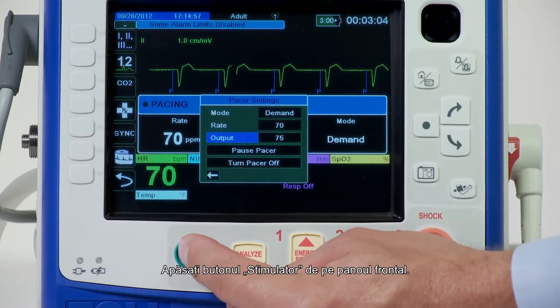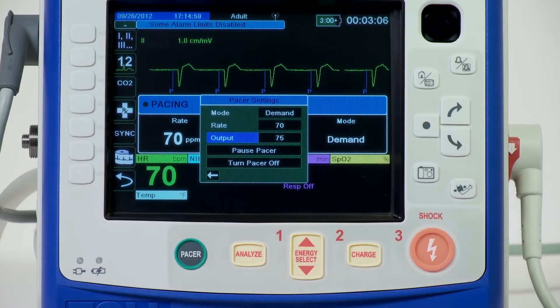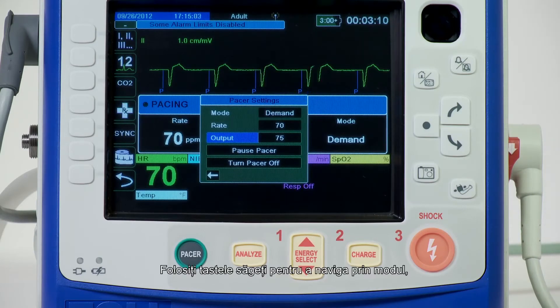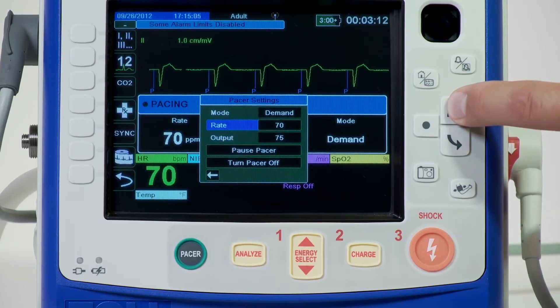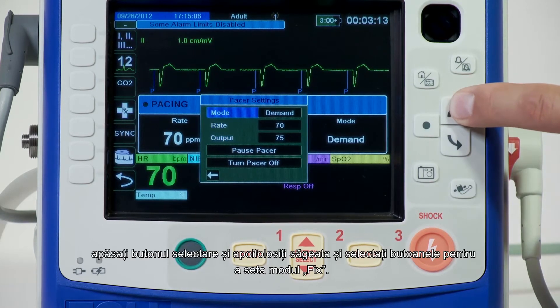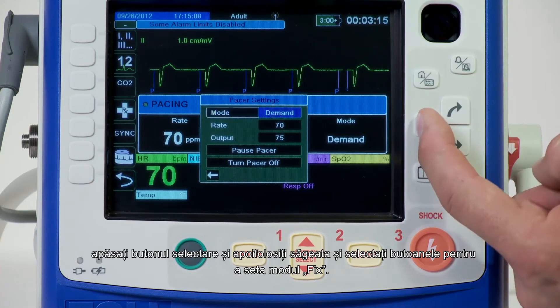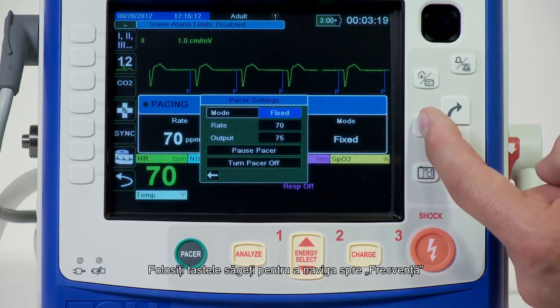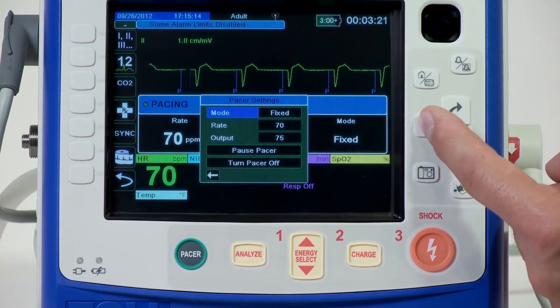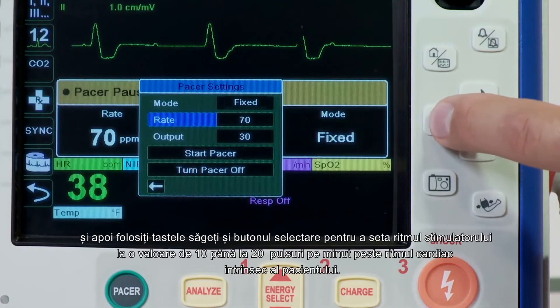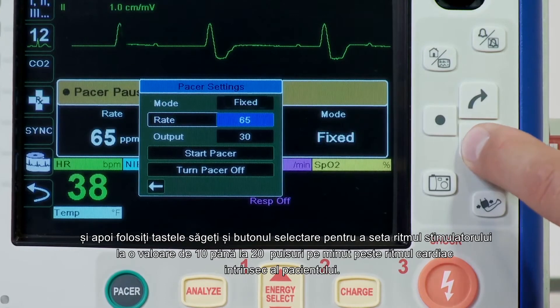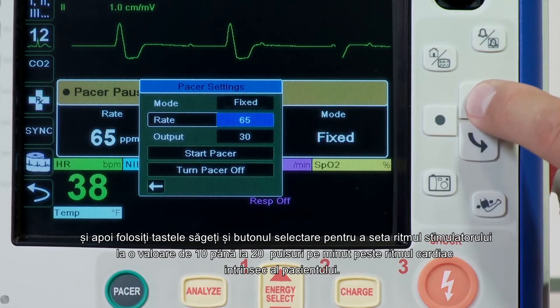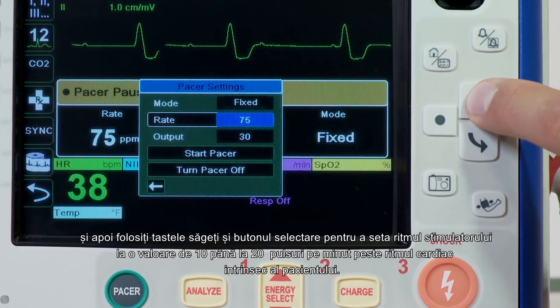Press the pacer button on the front panel of the unit. The pacer settings window displays. Use the arrow keys to navigate to mode, press the select button, and then use the arrow and select buttons to set the pacer mode to fixed. Use the arrow keys to navigate to rate, press the select button, and then use the arrow keys and the select button to set the pacer rate to a value 10 to 20 paces per minute higher than the patient's intrinsic heart rate.